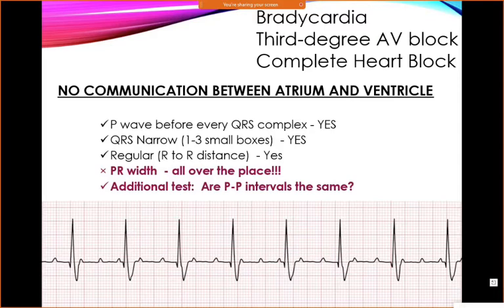So you're reliant just solely on your ventricle rate. And this is where it gets into things like junctional rate and things like that, which I'm not discussing. This technically is a junctional rhythm, meaning that the ventricles are running its own show. And that means that the rhythm is coming from the AV node rather than the SA node.